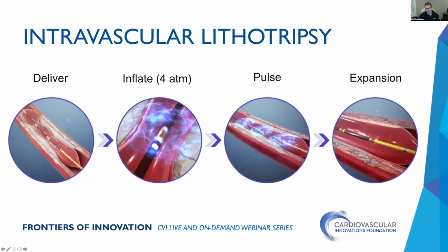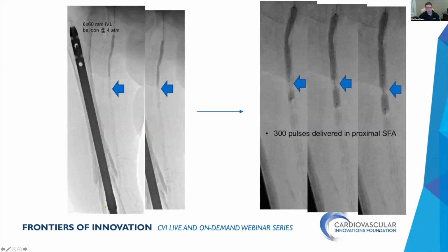And the downside of this catheter that I've come across, you have to be able to deliver it. And I was concerned about that in this case, but essentially low pressure inflation pulse, and hopefully you see expansion. So this is how things shook out.